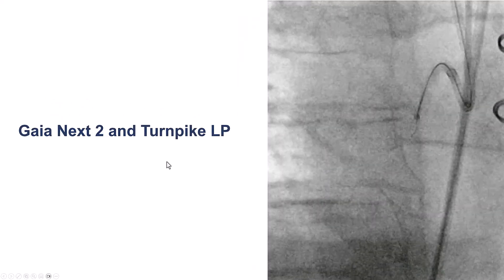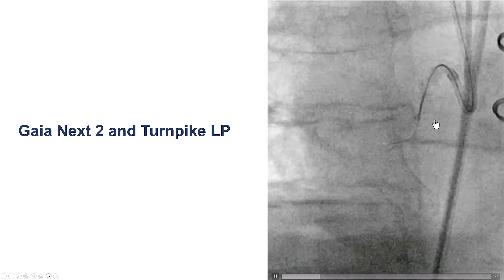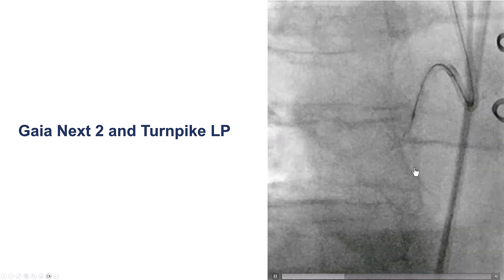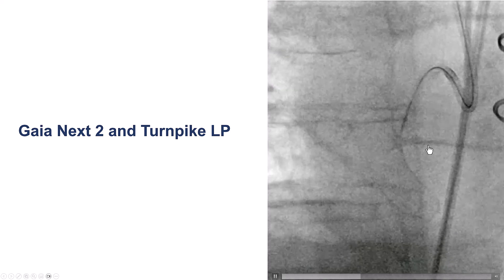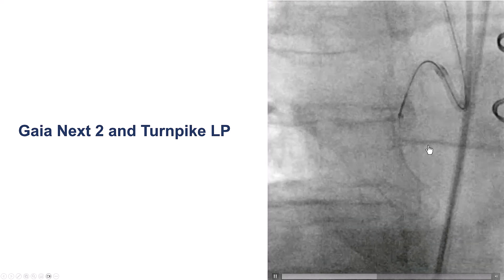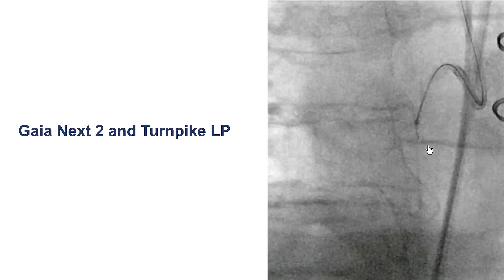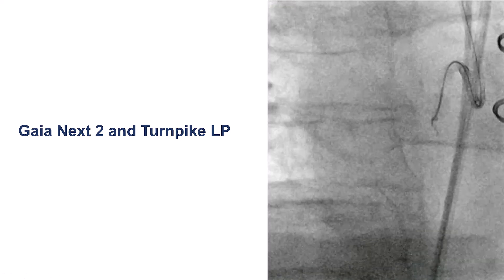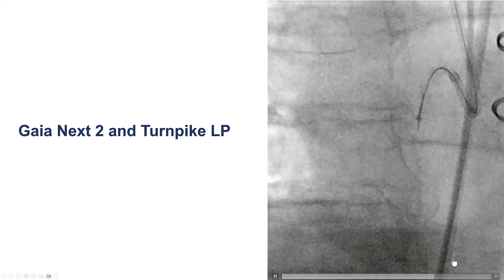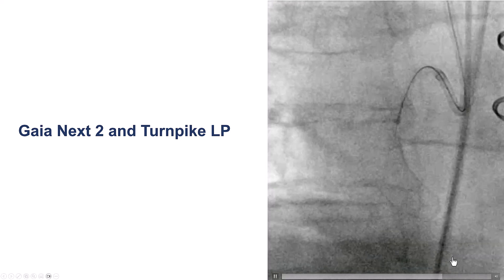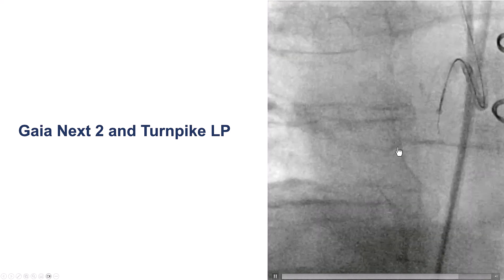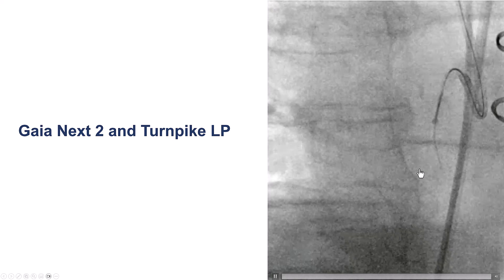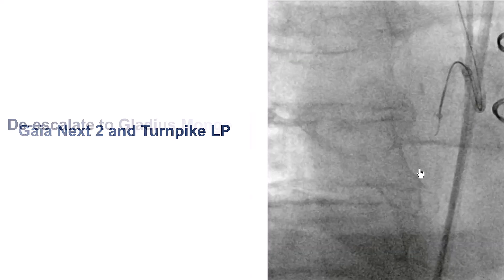We then tried with a Gaia NEX2 through the same Turnpike LP microcatheter. We did have some resistance along the proximal cap, we redirected the guidewire, and then we had difficulty, but at some point there was movement of the guidewire across the proximal cap, and it seemed to advance along the course of the vessel.